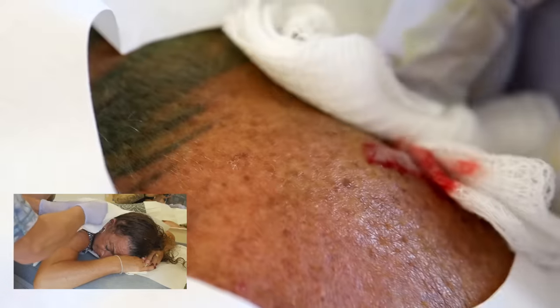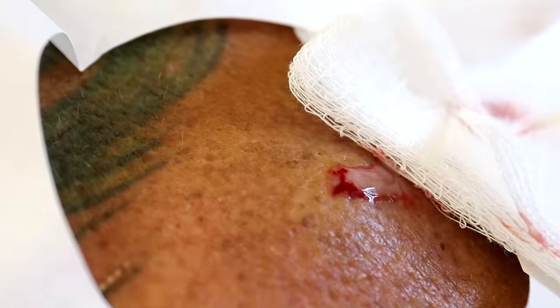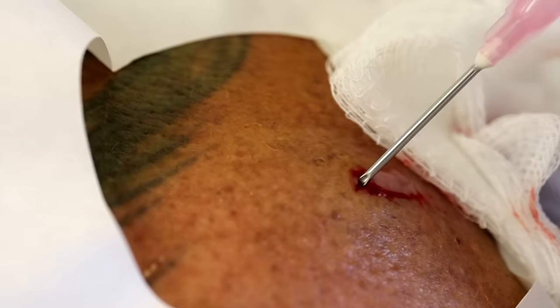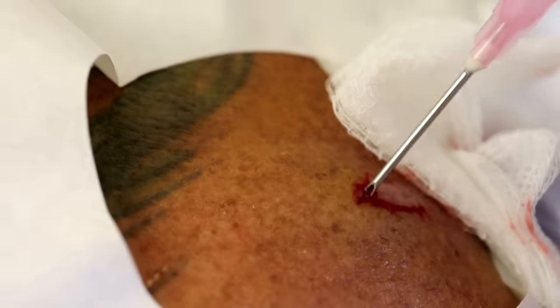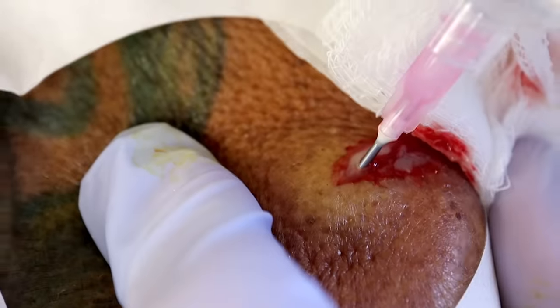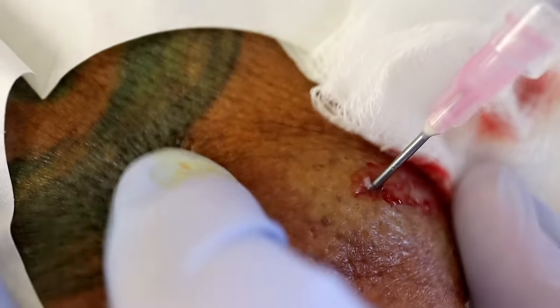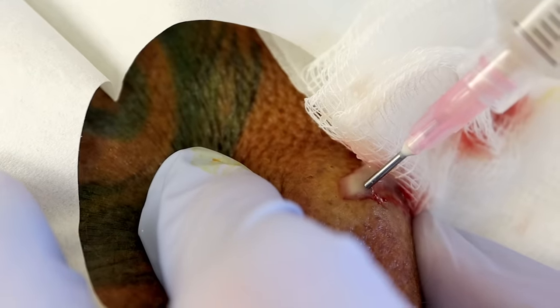You're blocking the pus stream. I'm trying to get that stream not to hit her and get all over her face. So this is just saline, and we're going to see if we can go through — we've created an opening. I'm just going to try to flush it. What are you doing right now? Flushing it. I'm going to flush it but it is weird. Oh, it's so good.